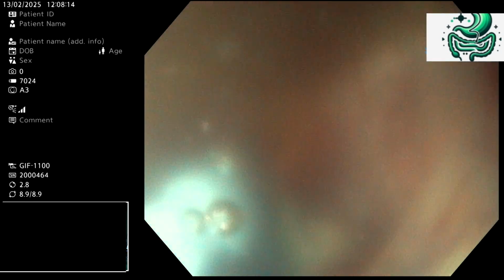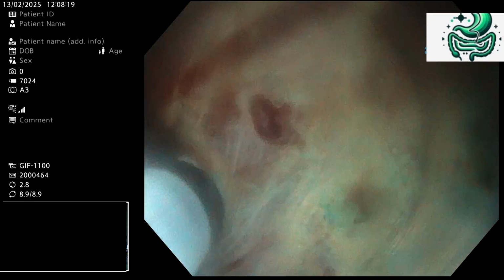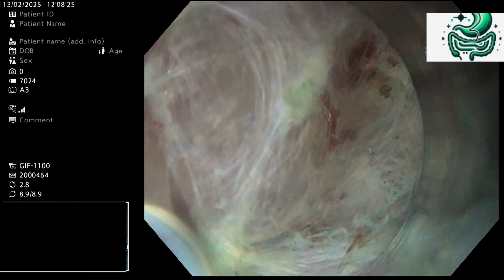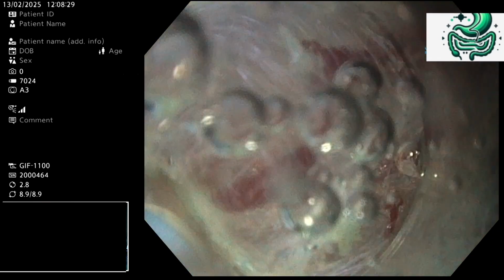What do you think, Murino? We need to shift to grasper, or we can use the knife under saline and do it like this? Yeah, we can control this bleeding with a knife. This is small bleeding, no problem. Okay. And in your expert hands, no problem at all. No, just because you are beside me.